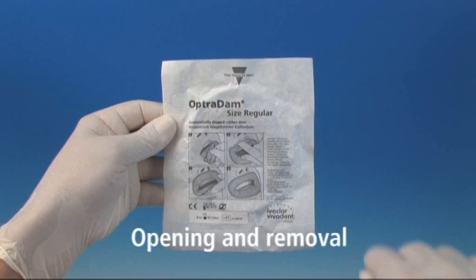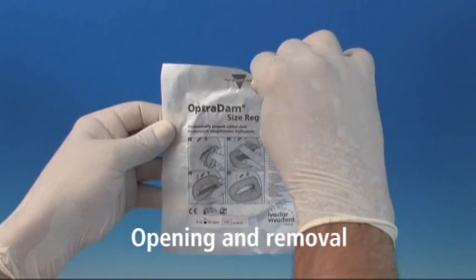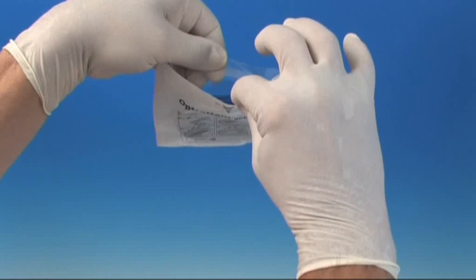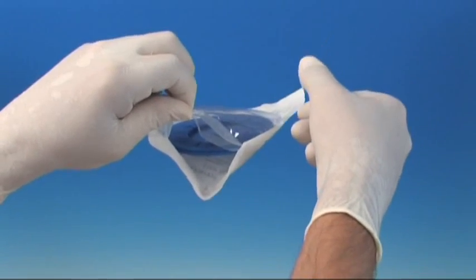Optredam is the first rubber dam to be available in hygienic disposable packaging. To remove it, peel the transparent part from the white part starting from the marking. Optredam is available in two sizes: regular and small.